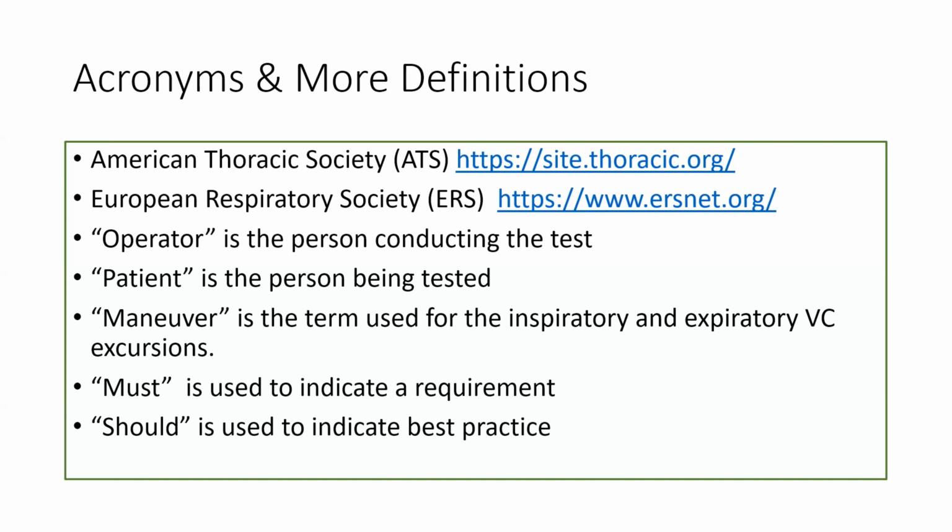Patient is the person being tested. They could be a patient, or they could be a biological quality control. They could be someone learning or teaching spirometry. The maneuver is the term that is used for the inspiratory and expiratory vital capacity excursion. Must is used to indicate a requirement, and should is used to indicate best practice.